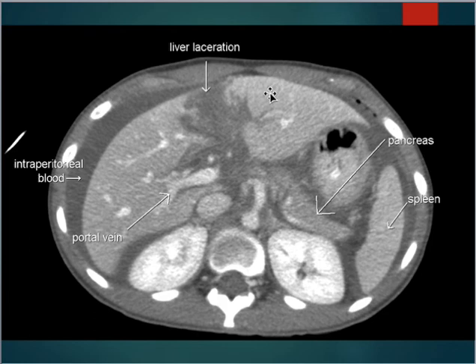This patient has a liver laceration. So you can see here, there's that laceration in the fluid inside that liver where it's separated into two different portions. You can see the pancreas here, the spleen, the stomach, and then you've got your left kidney and your right kidney here. Here's the inferior vena cava and the spine here, and then where the spinal cord goes.